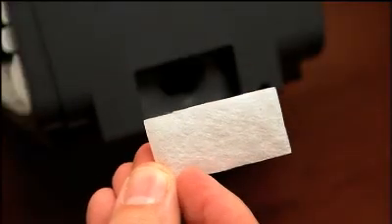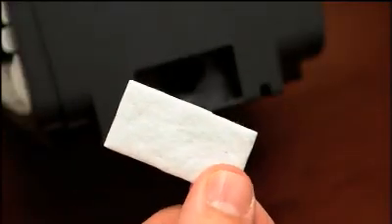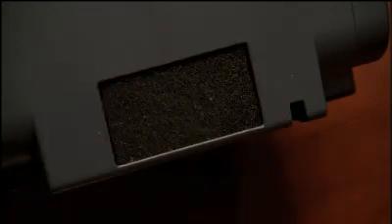If you have a white filter, put it in first, with the mesh side facing in toward the device. Then insert the gray filter. Do not operate the device unless you have a gray filter in place.